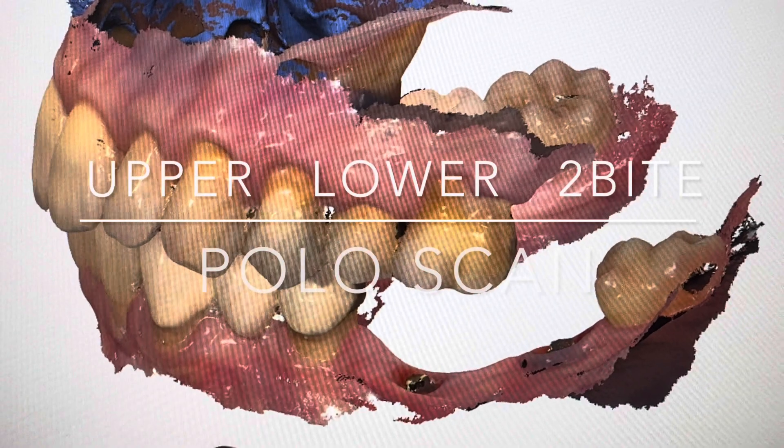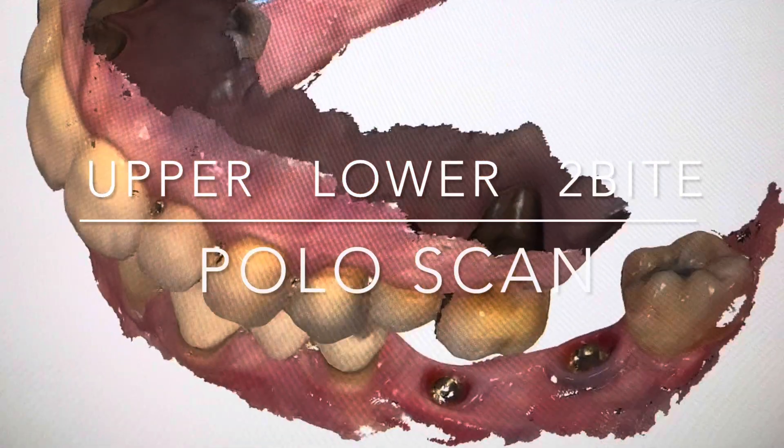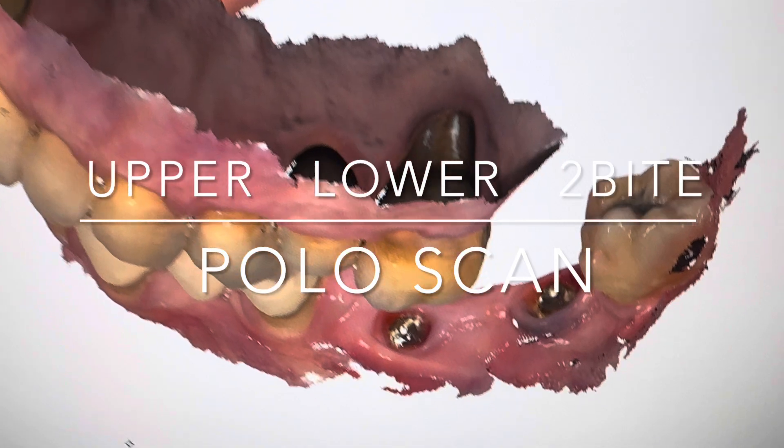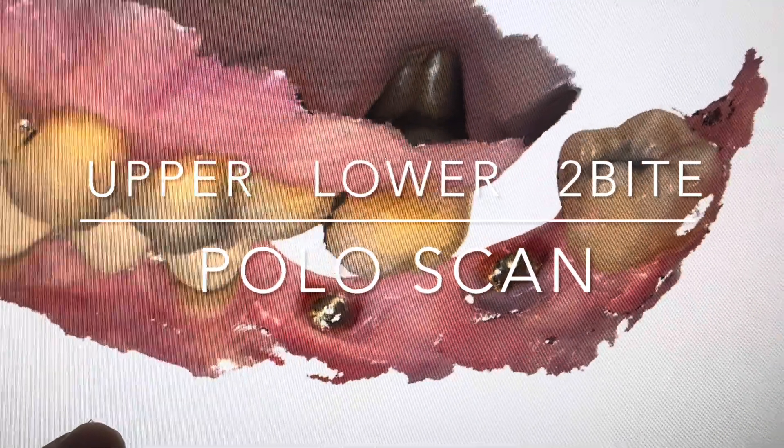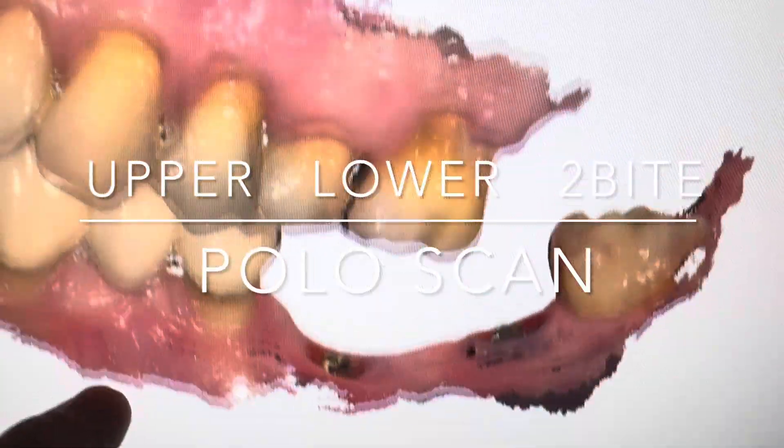We have to do a series of scans: an upper, a lower, two bite scans left and right, and then also a polo scan to show where the multi-unit abutments actually are in order to fabricate the bridge.